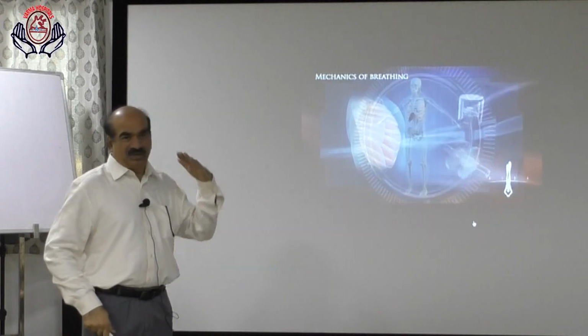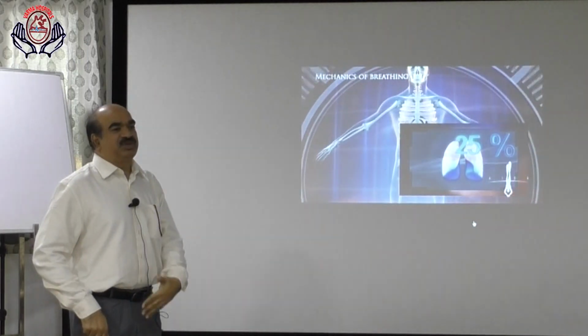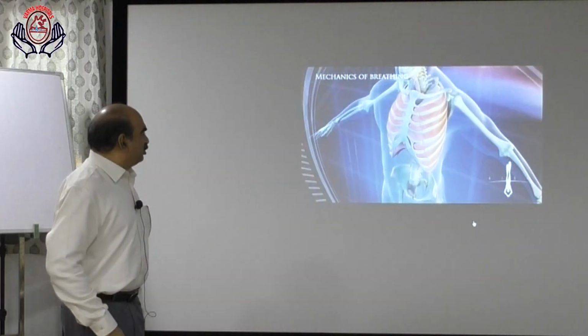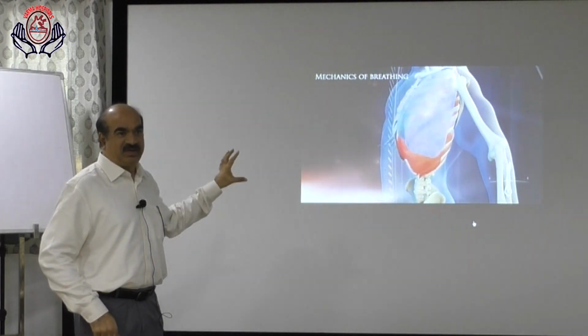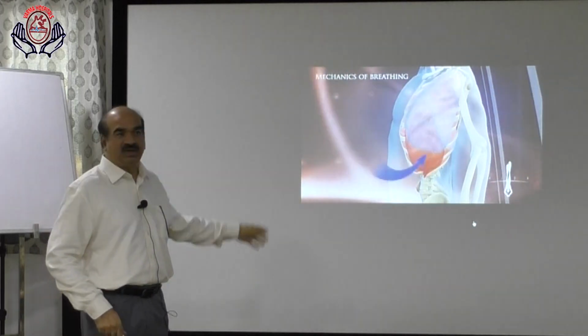The double piston model will increase the pressure from the ventilator and negative pressure from the diaphragm. The main idea of this video is we should mainly focus on diaphragm activity, the inspiratory effort of the patient, when the patient is on a ventilator.